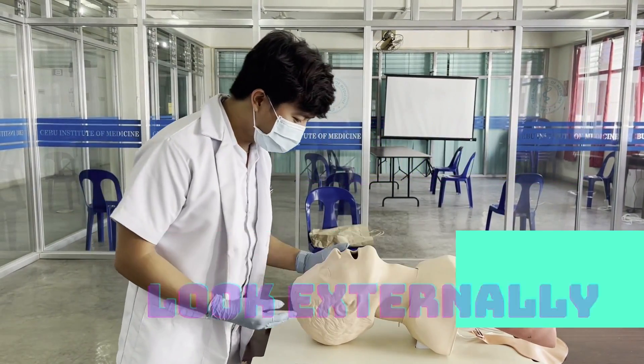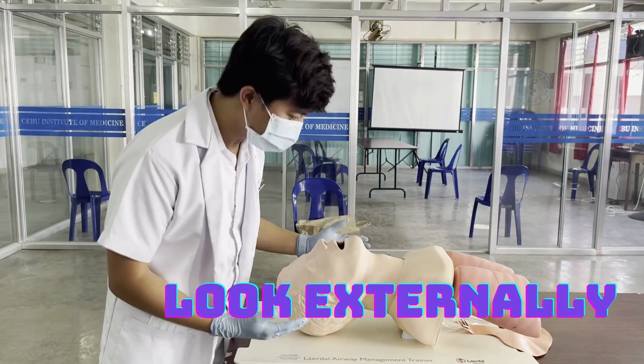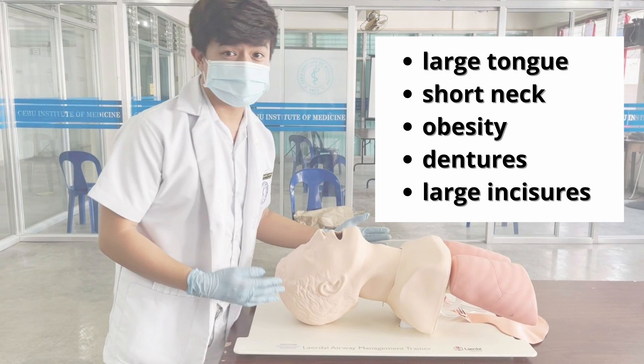Look externally for signs of difficult intubation, such as those with large tongue, short neck, obesity, dentures, and large incisors.